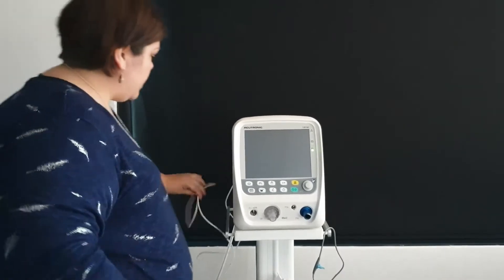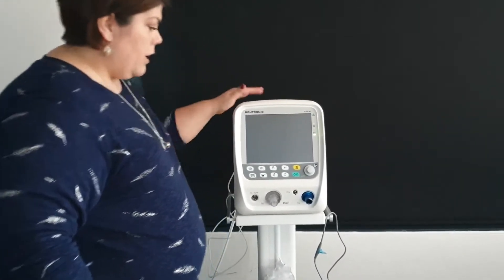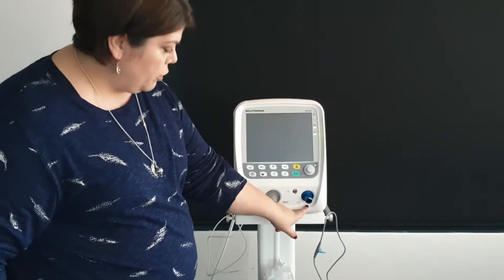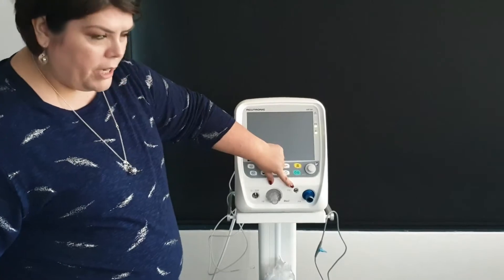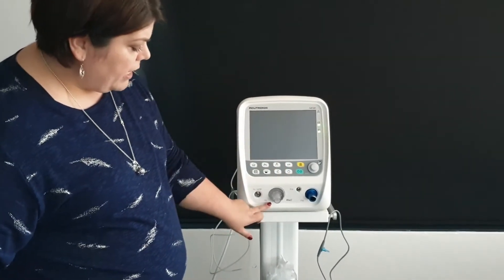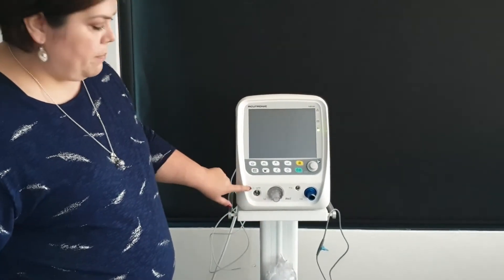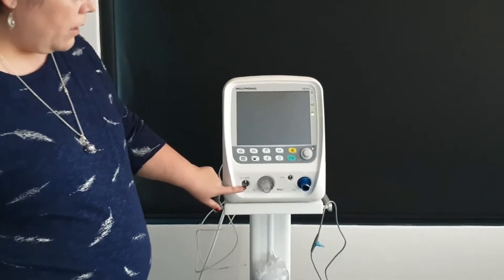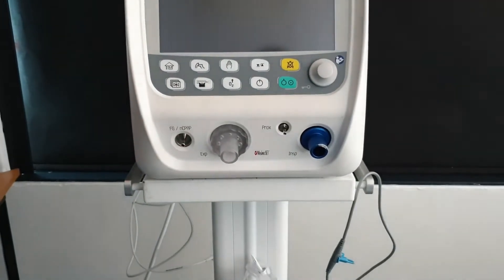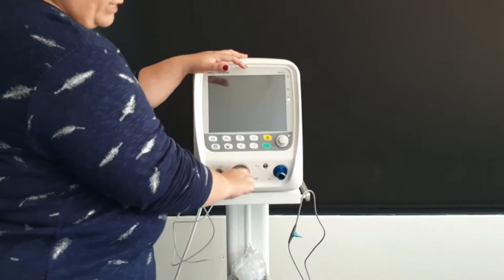At the front of the machine you will see an inspiratory limb marked blue, a proximal pressure line which always needs to be connected, an expiratory limb, and a nasal CPAP connection.